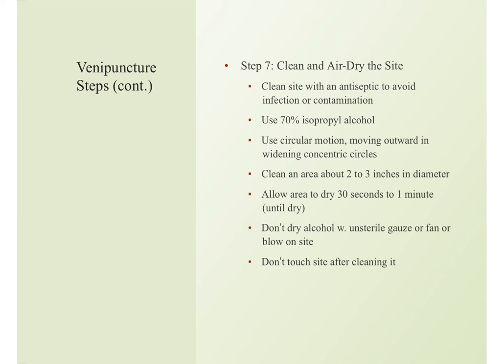That is what causes phlebitis. That's what causes issues. That is an infection control issue. If you touch the site again, you're going to clean it again. That's when you should pop the tourniquet. If you have to clean it again, go ahead and pop your tourniquet. Give the arm a minute to rest. Put your tourniquet back on, feel again, clean again, and start over. It's okay. The patient will appreciate it if you take your time a little bit, okay?